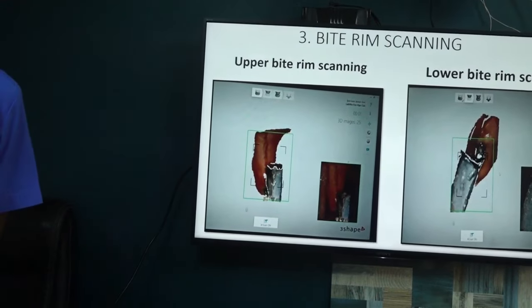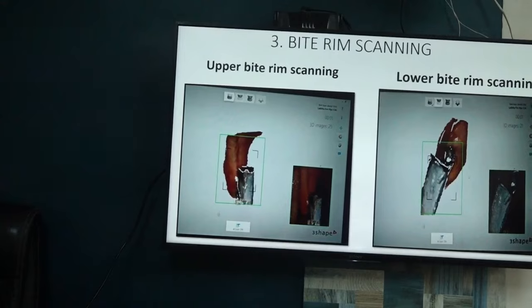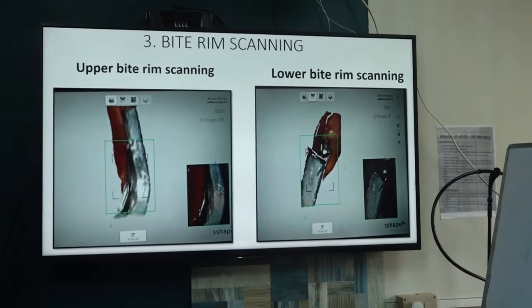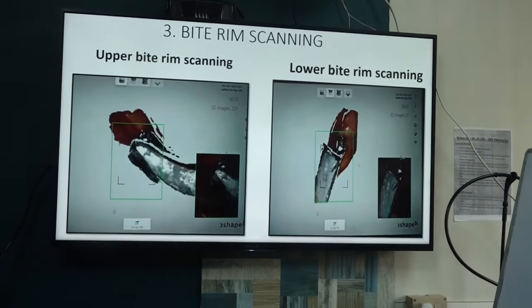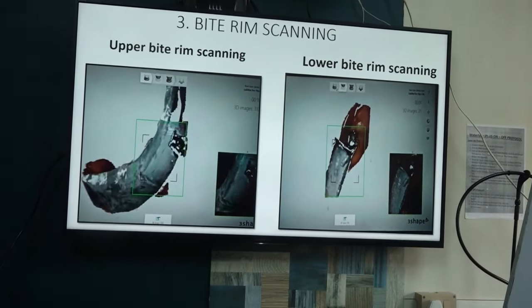Now, bite rim scanning. Upper bite rim scanning and lower bite rim scanning. Yeah, only one plate. The same protocol, same technique which you use for the implant scanning, right? Mild buccolingual tilting, not very much. Then buccally.